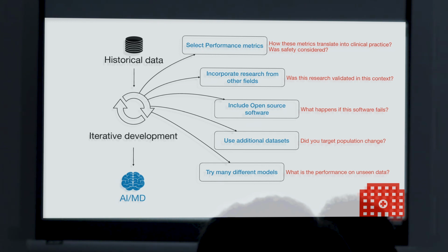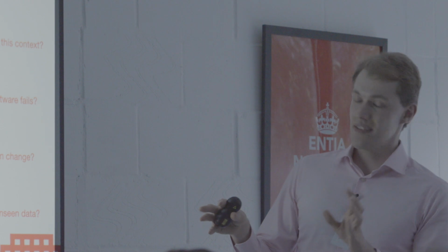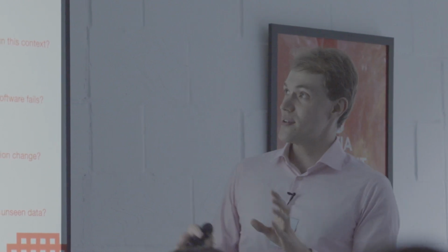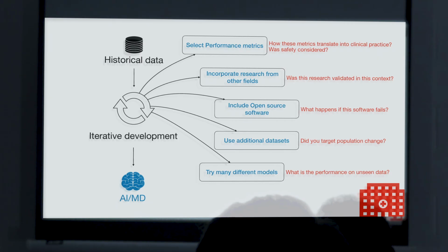Let's talk about performance metrics. They think, oh, is the performance metric we chose right for the job? What is the clinical relevance of this metric? How was safety assessed? There are many scenarios, and you can select a very good performance metric, but it might not necessarily account for all possible scenarios.